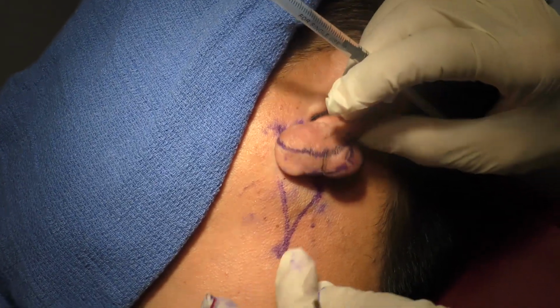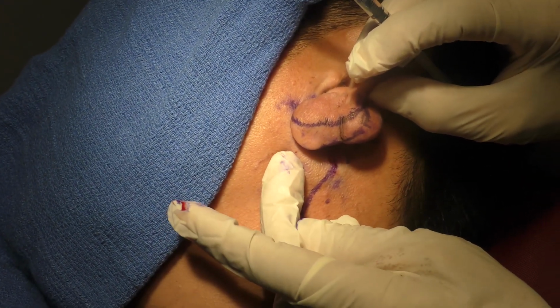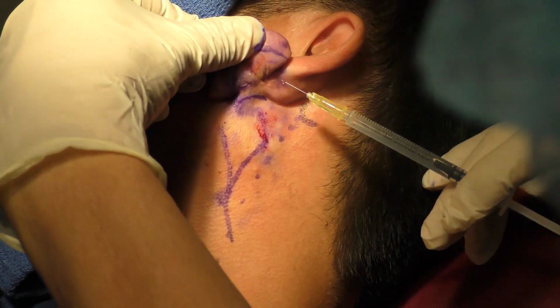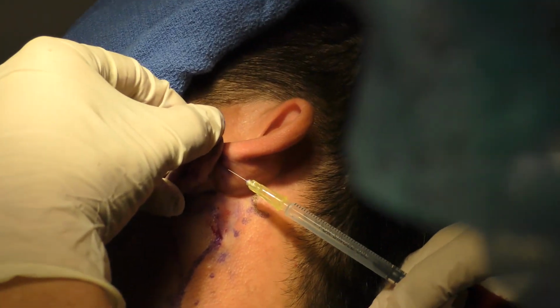After blocking the posterior branch and the anterior branch of the greater auricular nerve, we're now going to do local infiltration to minimize the bleeding.